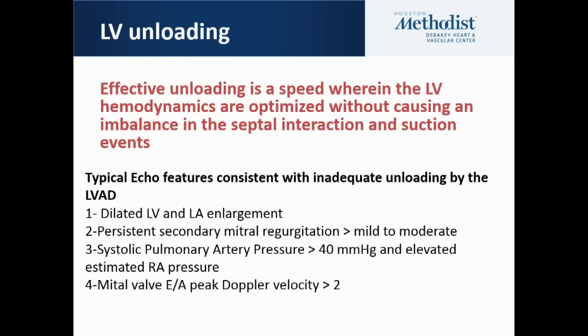Okay, so one modality is not enough for LVADs. LVAD assessment is a little bit complicated. It's a composite of looking at your patient, hemodynamics, and then echo, and then CT. We use CT in our center a lot, which has been extremely helpful in understanding the different complications of VADs that occur.